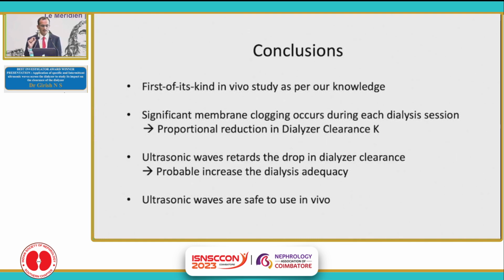And use of ultrasonic waves retards this drop in clearance, and probably, we are not sure yet, may increase dialysis adequacy if you apply it in controlled and ideal circumstances. And definitely the safety of these ultrasonic waves is proven beyond doubt in our study.